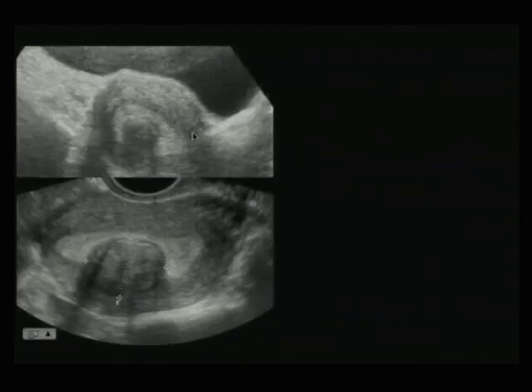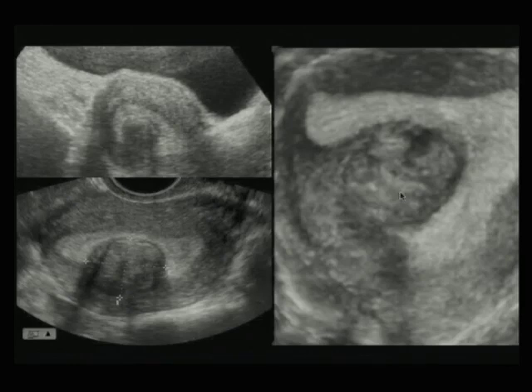Here's another example of a submucosal fibroid right here. You can see it in a couple of different planes. These are regular 2D scans, but when I take the volume, I can then be in complete control of all the information in the volume, and I can get this image to be such that the fibroid is tangential to the wall of the uterus. And then I can use the endometrium to outline that fibroid and show us exactly where that stalk is and where the obstetrician needs to go in there to resect the fibroid.